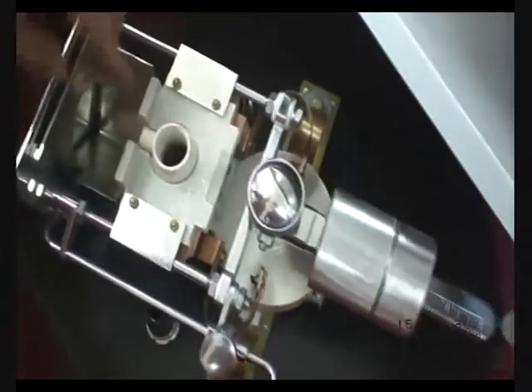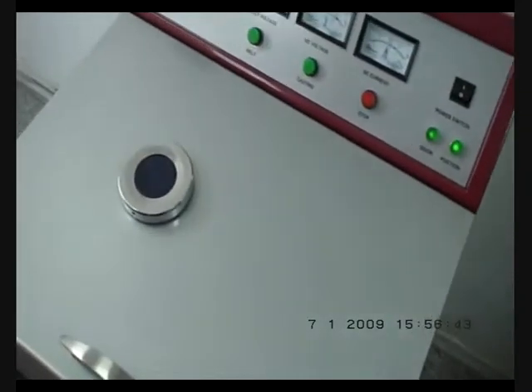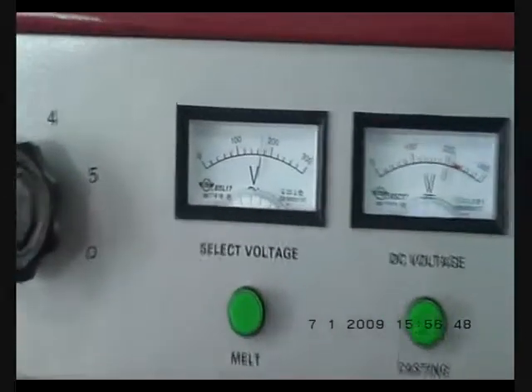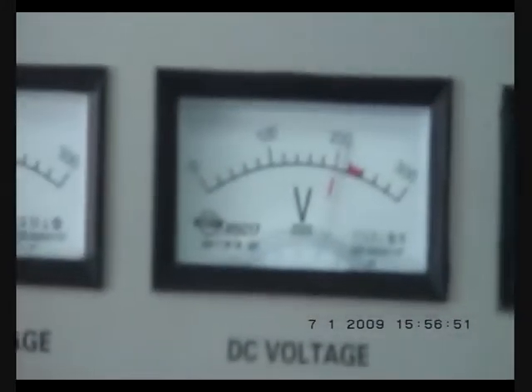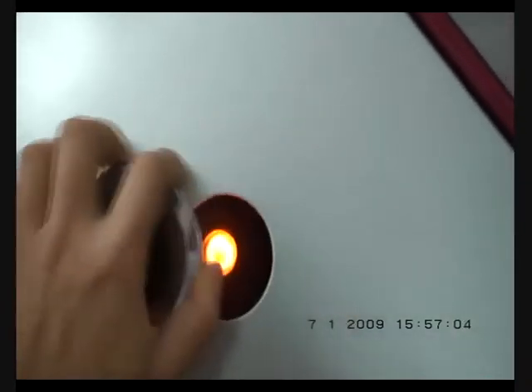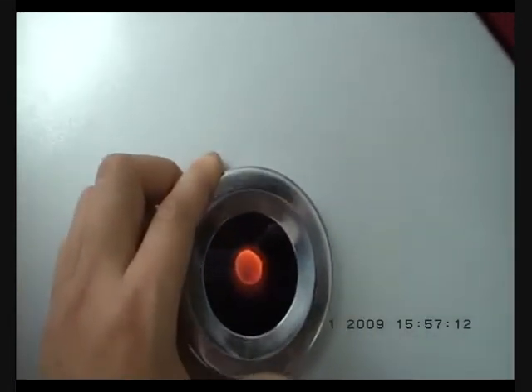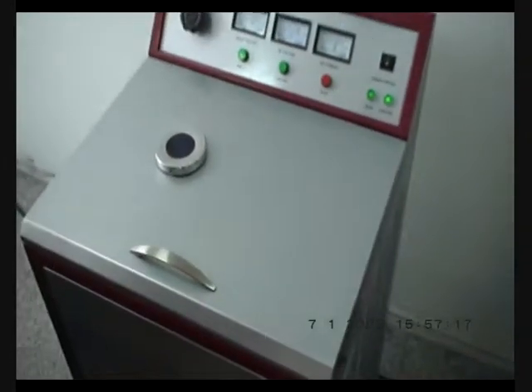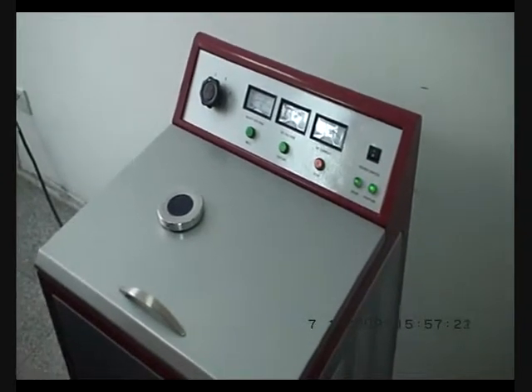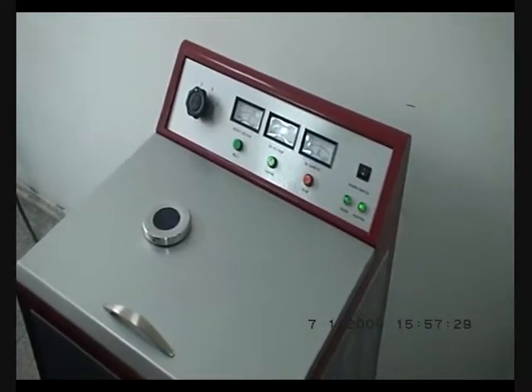Now we'll put in a crucible with the alloy. The voltage should be 180 volts, 210 ampere. You can see the alloy is starting to melt. If you have many castings in one day, after every five castings you make, for the sixth casting you have to rest the machine for two minutes before you make another casting.